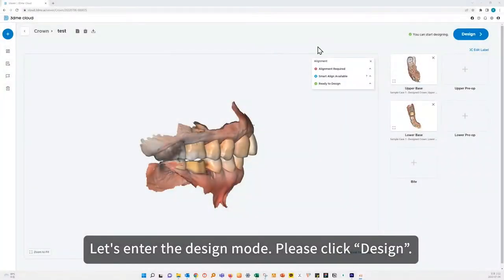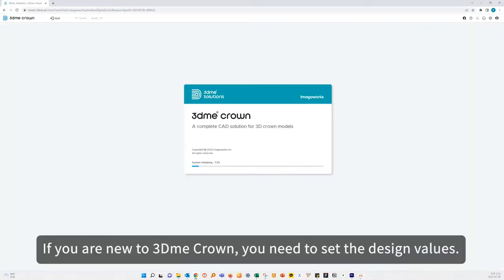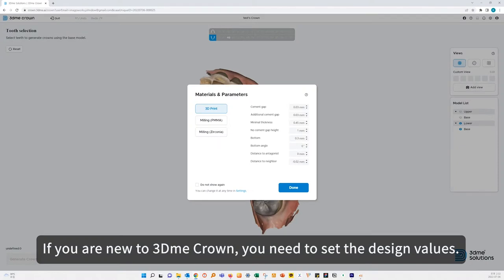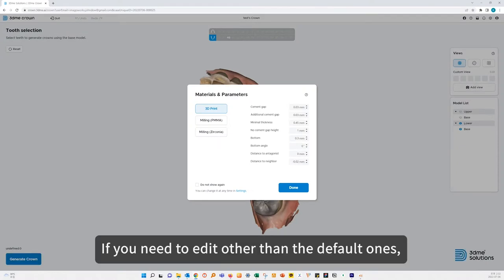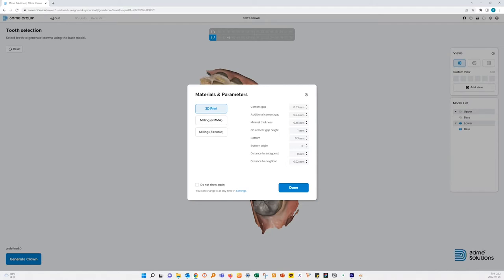Let's enter the design mode — please click Design. If you are new to 3Dme Crown, you need to set the design values. If you need to edit values other than the default ones, you can change the settings through the settings menu at the top right.